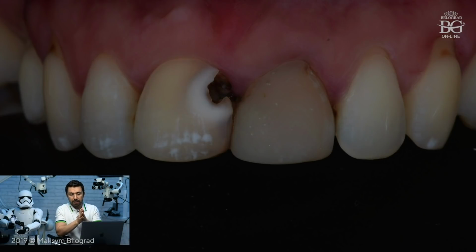And considering the fact that the teeth are non-vital, and the patient was super afraid of surgery, literally she was really afraid, I said, okay, if we just do restorative treatment, from my side I would be super accurate in terms of fit of restoration, because in this case, fit of restoration will play the main role.